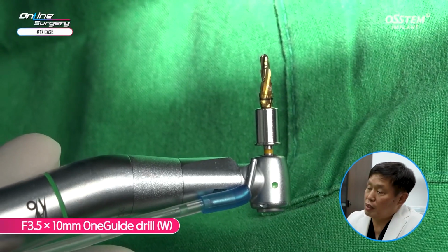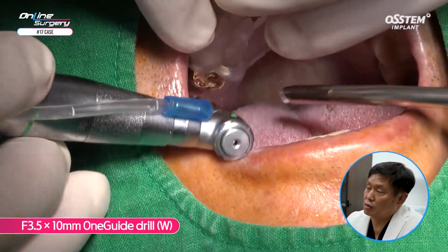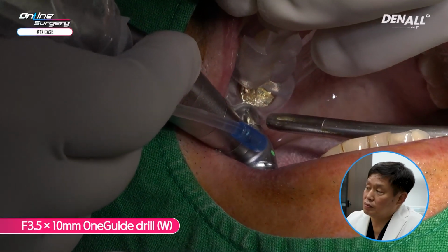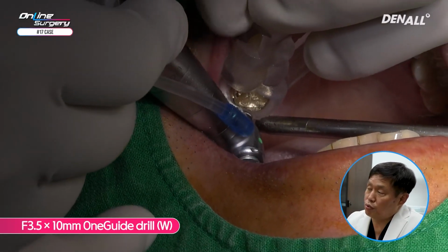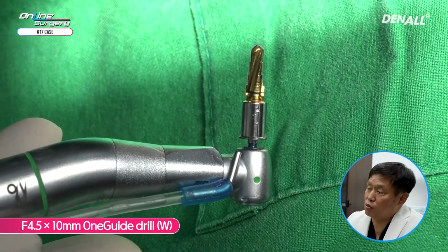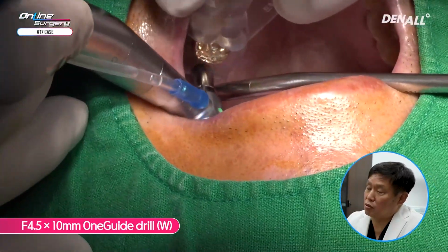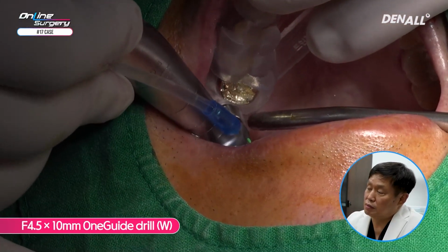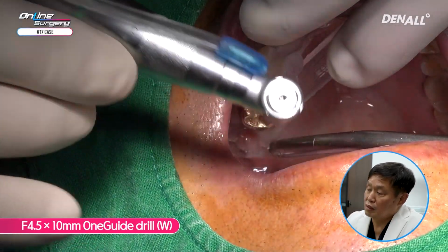3.5 by 10 millimeter OneGuide drill was used. Because this was where socket preservation was done, for a final drill, 4.5 by 10 millimeter drill was used. 4.5 by 10 millimeter OneGuide drill was used for final drilling. 4.5 by 10 millimeter drilling was done.